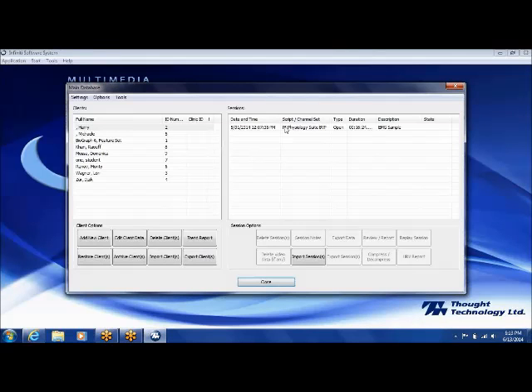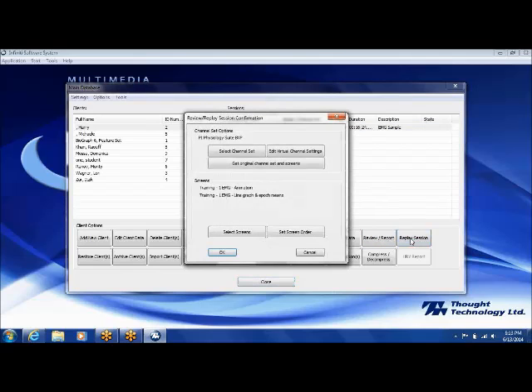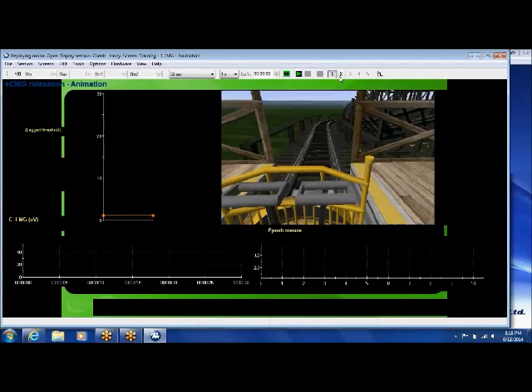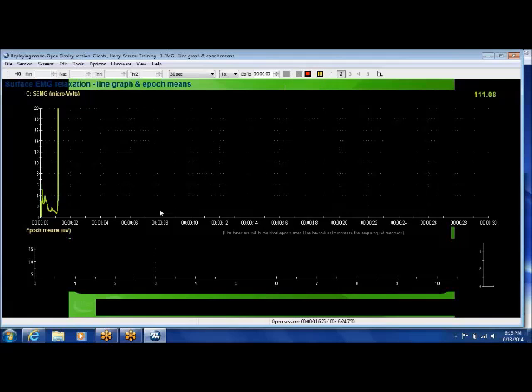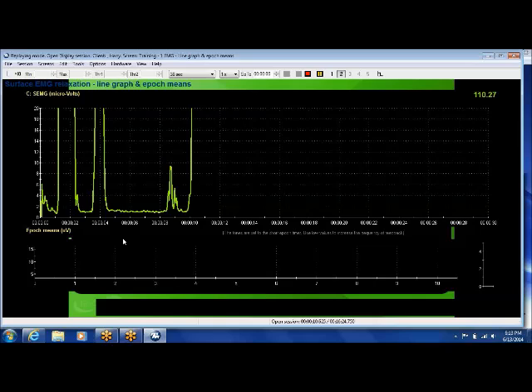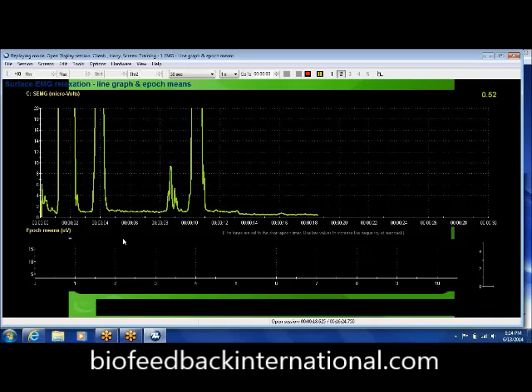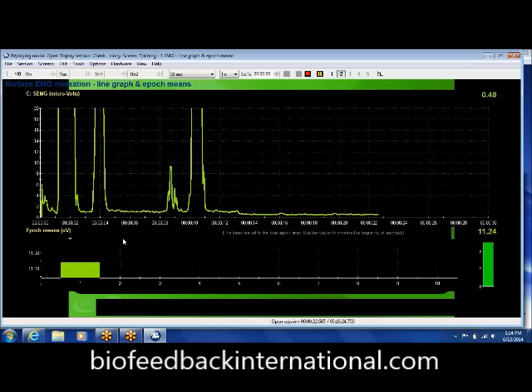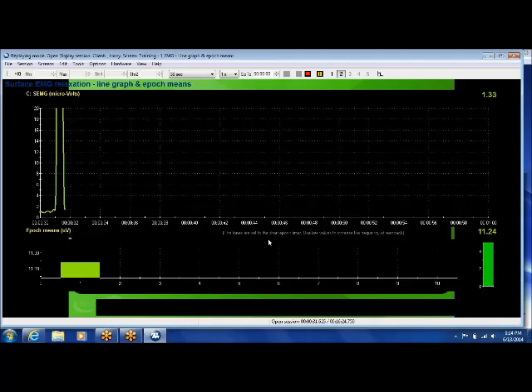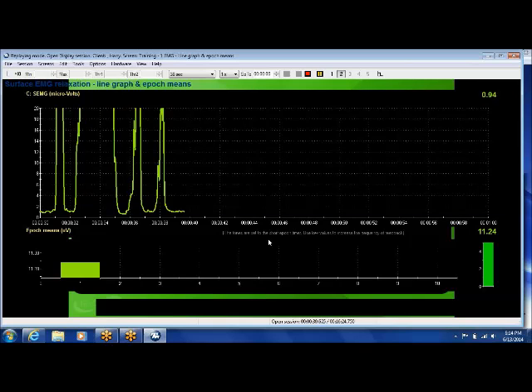Another thing I can do in the database, instead of review report, is replay session. If I do replay session, now I can not only look at the data as it was recorded, but I can play it back so it looks just like it did during the recording. This is not a live session — it's just playing back data from when I recorded it. This is useful for practicing with the software, demonstrations without hooking someone up, or replaying it for a client so they can see what was happening. Sometimes clients work eyes closed and didn't see it, or you just want to point things out.